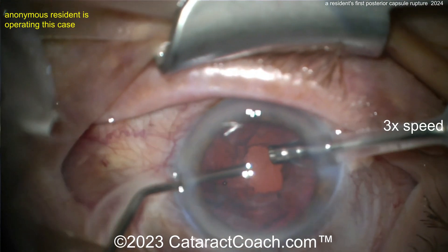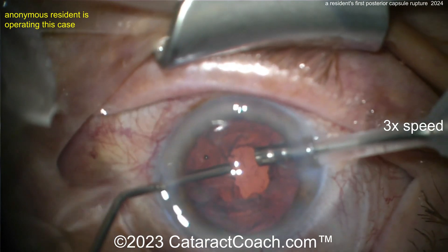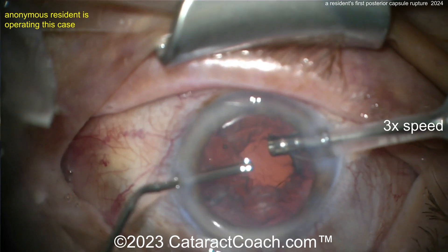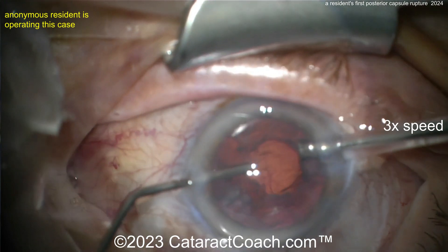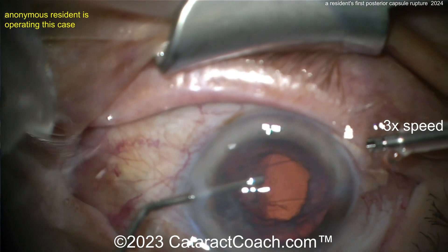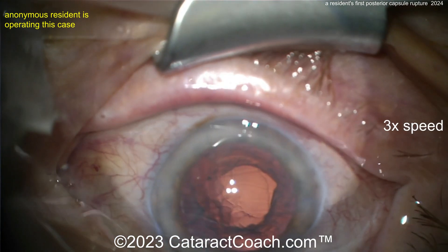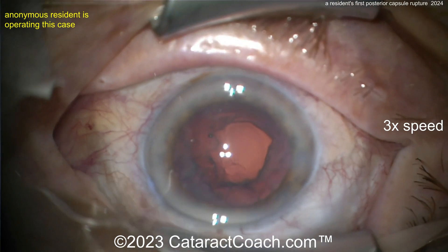Remember, your risk of endophthalmitis goes up, your risk of retinal detachment goes up, and your risk of cystoid macular edema goes up. You don't want that lid margin in the way. Come off the phaco pedal and come out of the eye slowly. Note: this is at 3x speed — the resident was doing this for six minutes in real time.